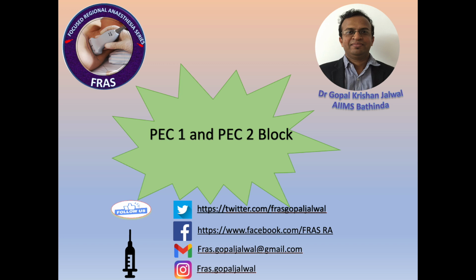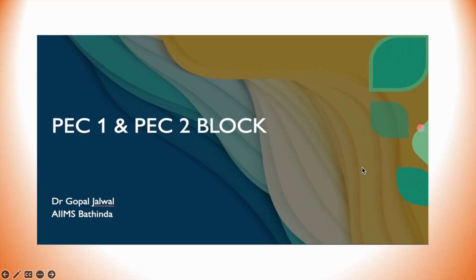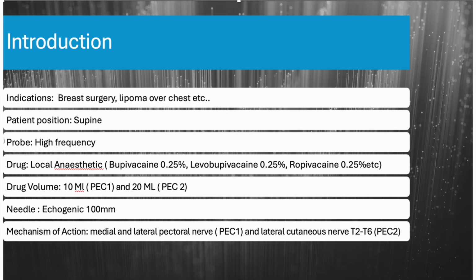So in this video I am going to demonstrate how to perform the PEC1 and PEC2 block. So, PEC1 and PEC2 block. The indications of PEC1 and PEC2 blocks are breast surgery and lipoma over the chest.